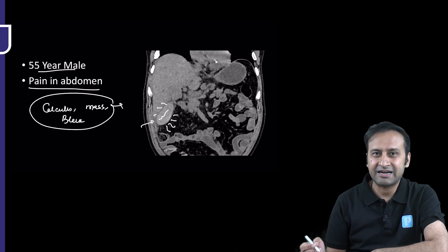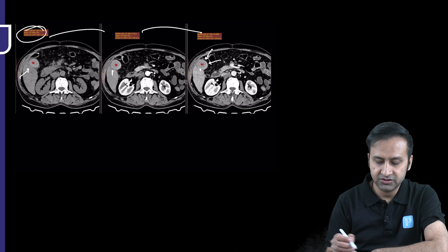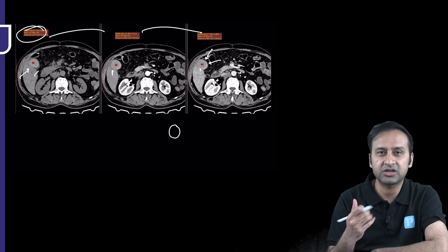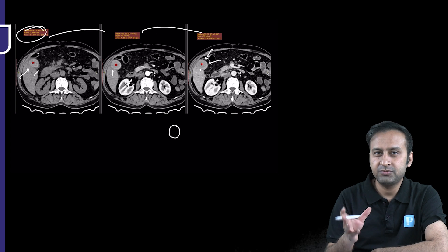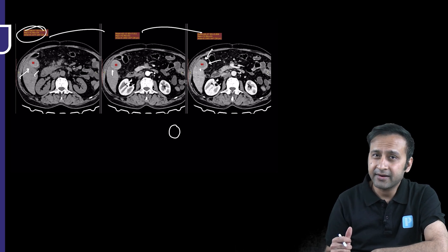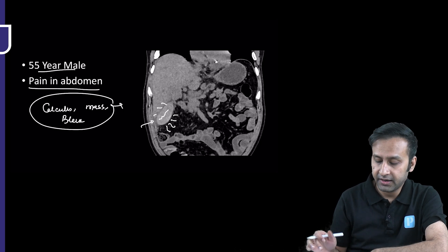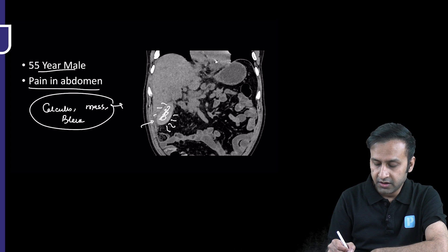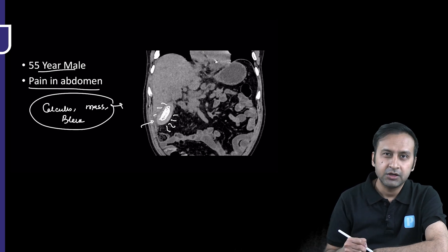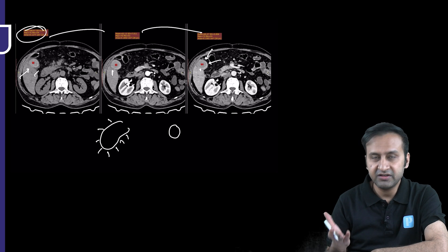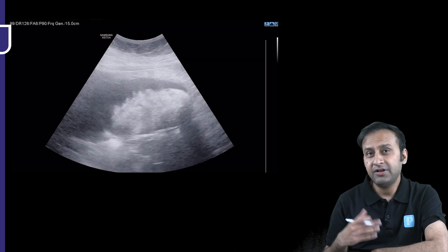Looking at this, is it a stone? Stones do not fill the gallbladder like this — if there were a stone, you would see one spherical structure. The entire GB appears hyperdense. Does it look like a porcelain gallbladder? Certainly not, because porcelain gallbladder shows calcifications along the wall, whereas here the hyperdensities are present along the inner lumen of the gallbladder.